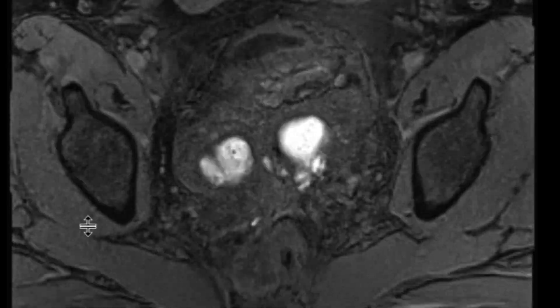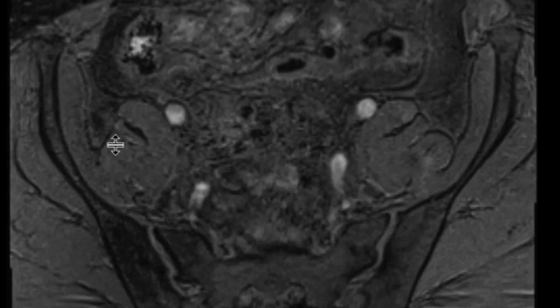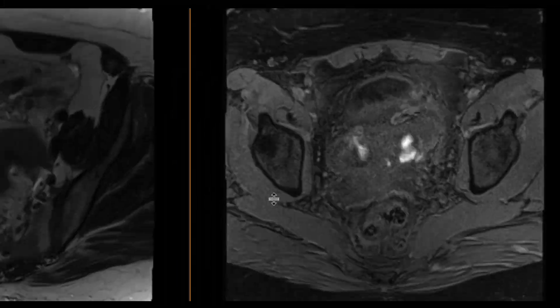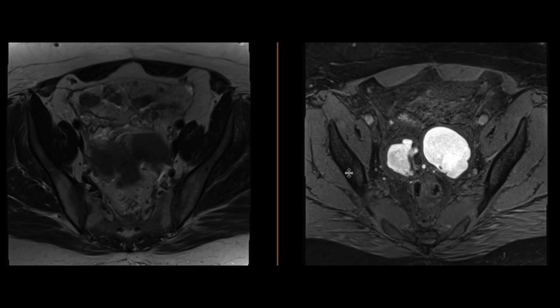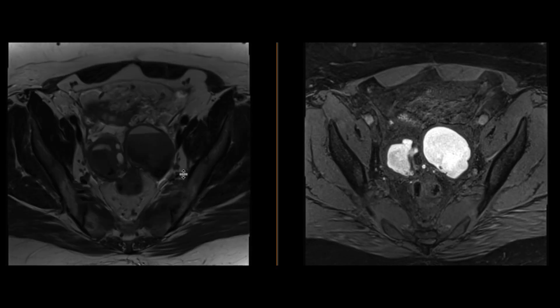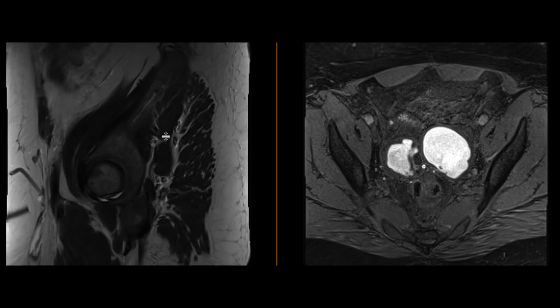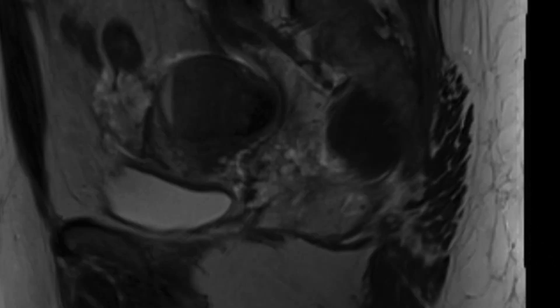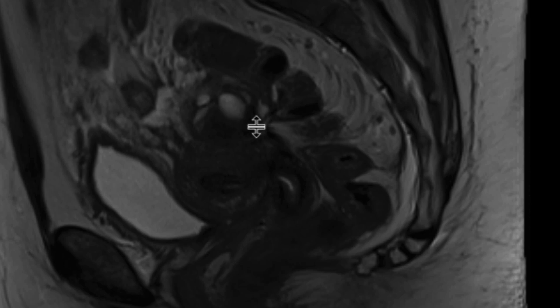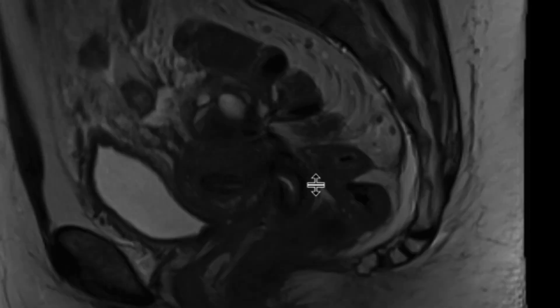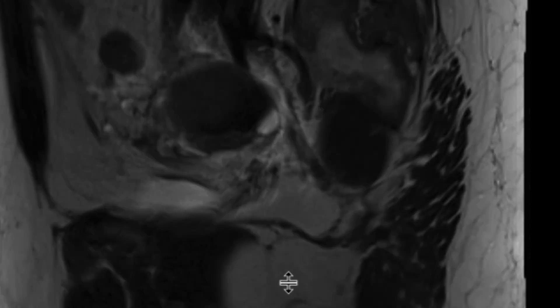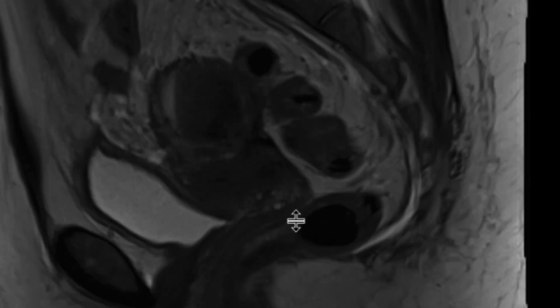These findings are classic for endometriomas with extensive endometriosis present in the pelvis — bilateral endometriomas — and there are all these dense adhesions between several structures. We can see these adhesions very nicely on the sagittal image, showing how loops of bowel are tethered to the posterior aspect of the uterus and to both adnexal endometriomas.